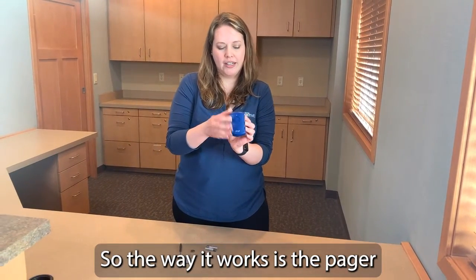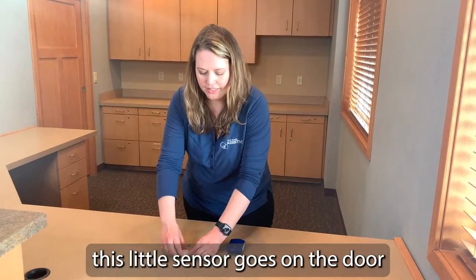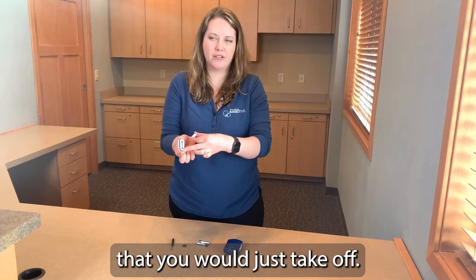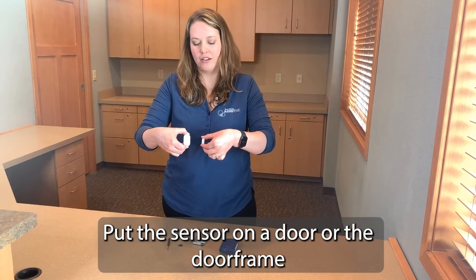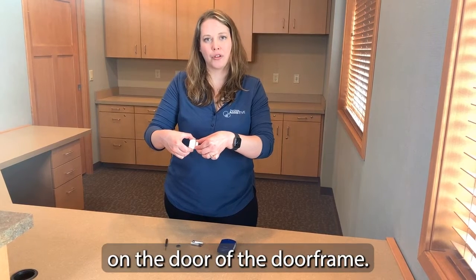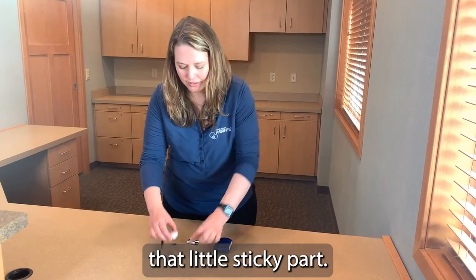The way it works is the pager is worn by a caregiver, and then this little sensor goes on a door. There are little sticky Command strips on there that you would just peel off and put the sensor on a door or the door frame. It doesn't really matter which one's on the door and which one's on the frame — they both have that little sticky part.